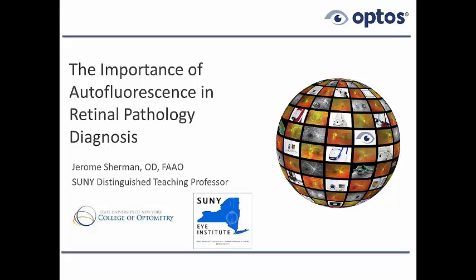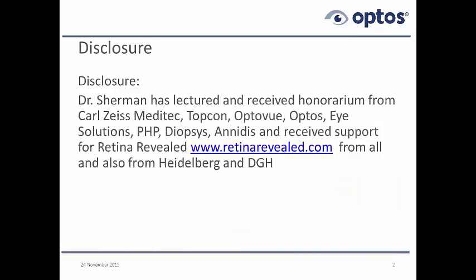The topic is obvious. It's been introduced before. The importance of autofluorescence in retinal pathology diagnosis. And as for disclosures, I pretty much lecture for all the different companies within the ophthalmic world. And of course, Optos is one of them, but there are lots of others as well.